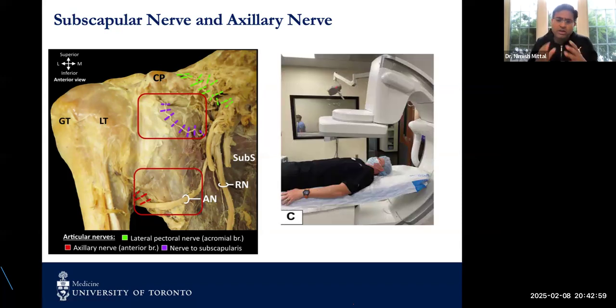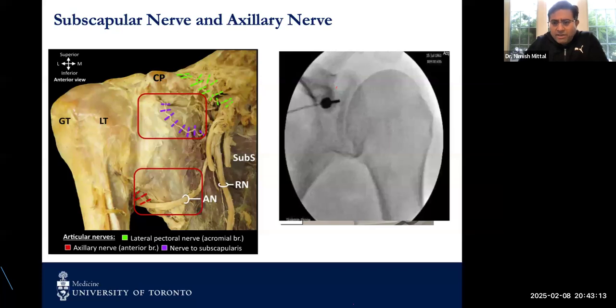With fluoroscopy, there are different positionings that have been shown. What you have to mostly do for these is give around 10 degrees of cephalad tilt, around 10 to 15 degrees of ipsilateral oblique for them to have a true glenohumeral joint view. And this is how the lesion that we do. In this image, you'll see the coracoid here. This is the upper lateral border of coracoid. And this is kind of like a thumbs down kind of a view if you look at it here. So you can see the coracoid around here.